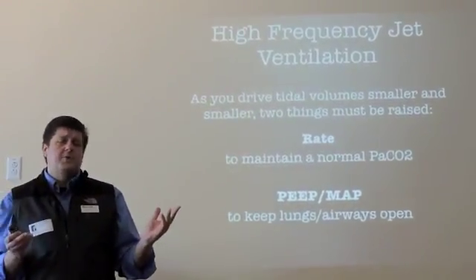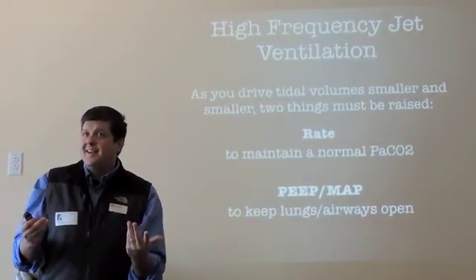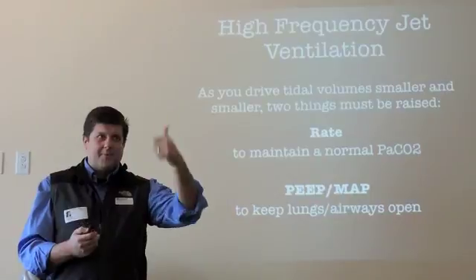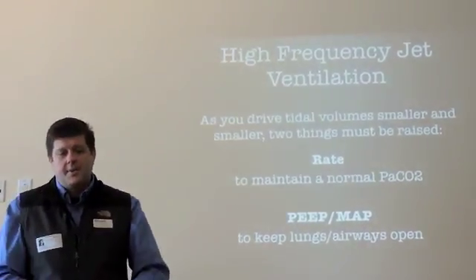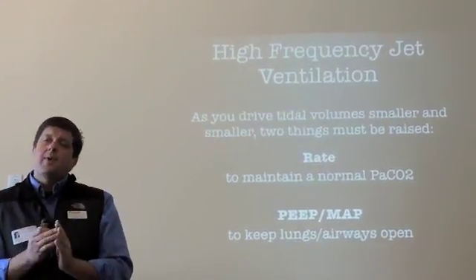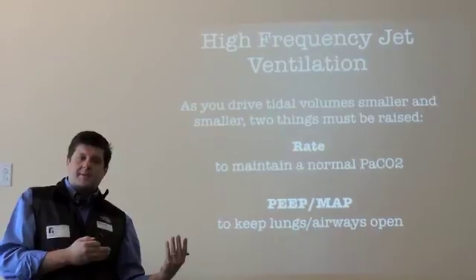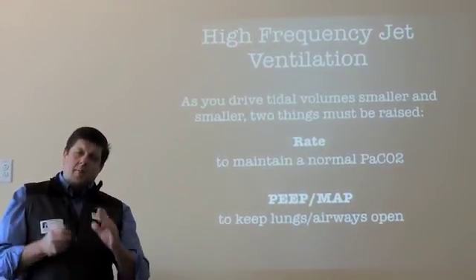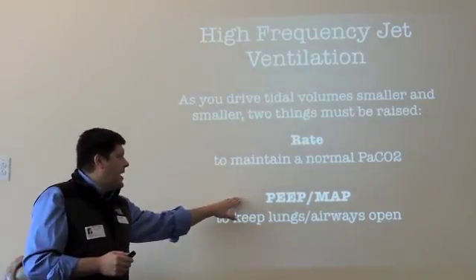Now, we don't think about this too much with an oscillator, right? Because when we put kids on the oscillator, what do we do to the mean? We always crank it up, right? We always add 2 or 3 to whatever we're at on a conventional ventilator or something along those lines. And therefore the airways are always stented open and resistance is kept to a minimum, and that's what makes it pretty effective. But on the jet, it's a little bit different because you have to adjust PEEP.